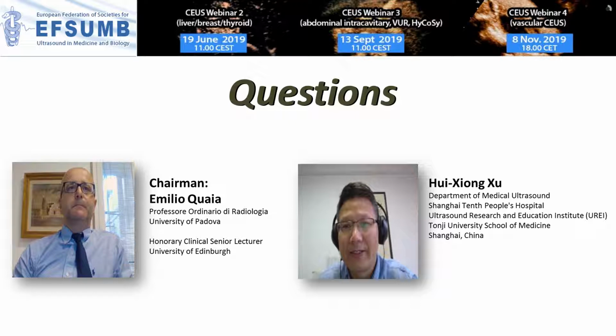Okay, I think this is actually an evolving field, and I think it's very important to remind everyone that in Europe, breast is actually a registered indication for contrast-enhanced ultrasound. So breast is a registered use for contrast-enhanced ultrasound. So I think it's very important to underline this topic. So thank you very much, Professor Xu, for your presentation. Thank you.